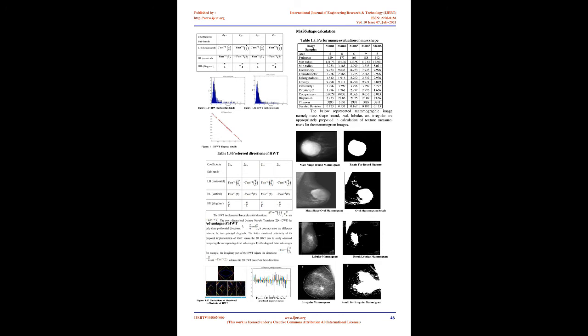The wavelet transformations are characterized by two features: the mother wavelet, MW, and primary resolution, PR, number of iterations. An appealing particularity of the 2D DWT is the interscale dependency of the wavelet coefficients. The main advantage of the implementation of 2D DWT is its flexibility, as it inherits from the Daubechies, Symlet, or Coiflet family. Discrete wavelet transform, DWT, for an image as a 2D signal can be derived from 1D wavelet transform.